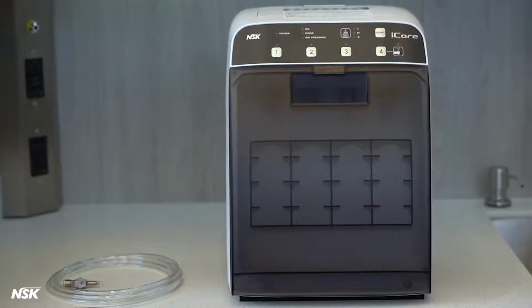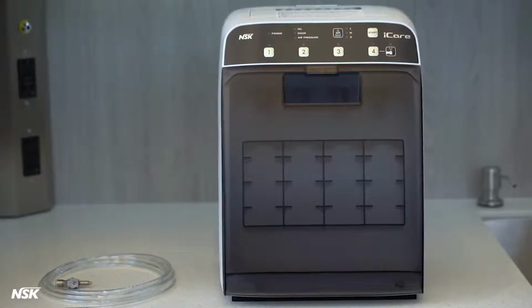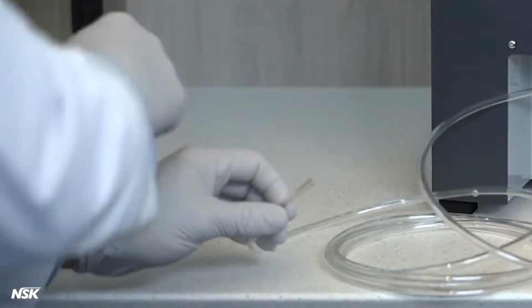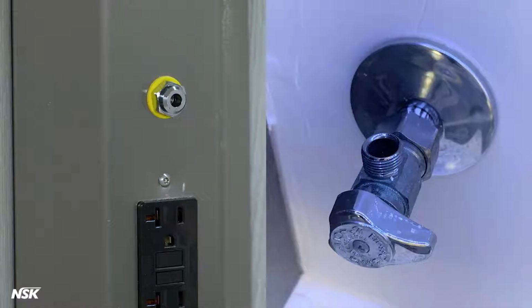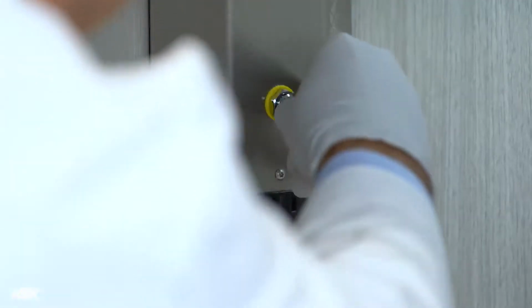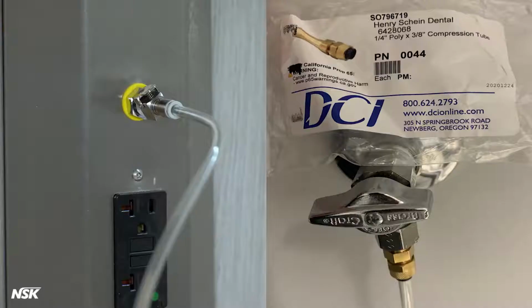Installation. Now, let's install your iCare lubrication machine. The first step is to locate the air valve. Then, connect the air line to the air valve in your practice. iCare is normally installed in the sterilization area to a 3/8-inch air valve. Use the 5mm or 1/4-inch air tube included in the package. You can use a proper adapter on that valve to make a secure connection with the tube using this part. For this demonstration, we use a pre-installed Quick Connect.